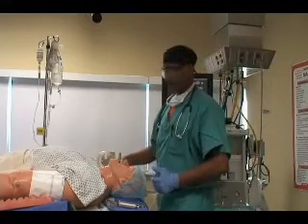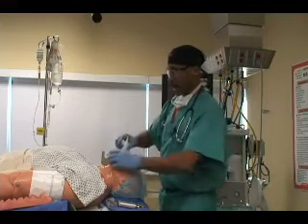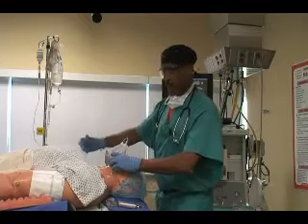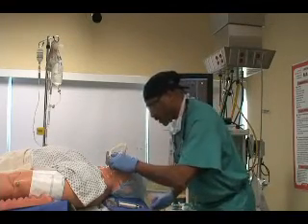Alright, from this point, your patient has his IV in and he's being oxygenated. His medications are given through his IV. You're talking to him as he goes to sleep. Sir, you're going to be going to sleep soon?